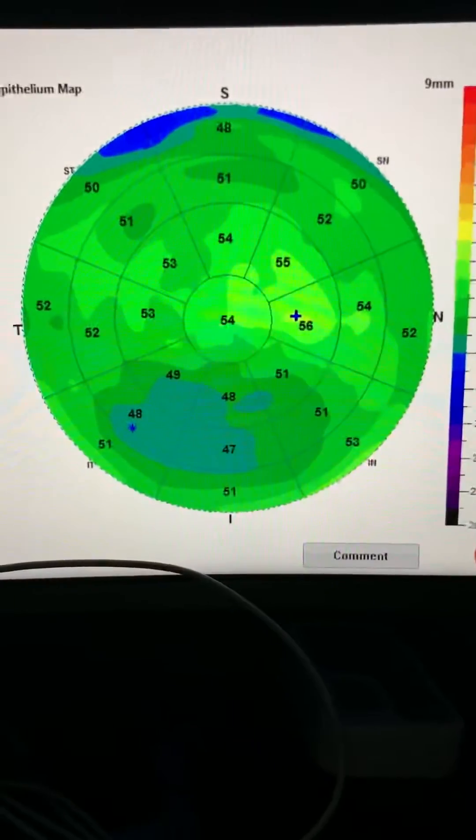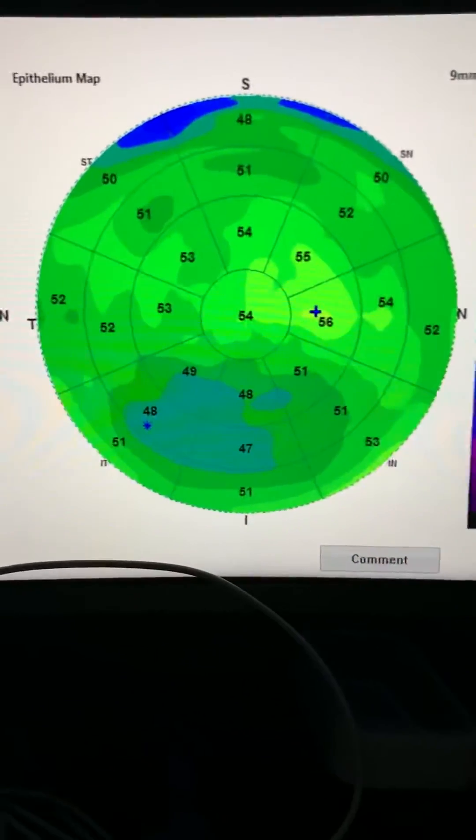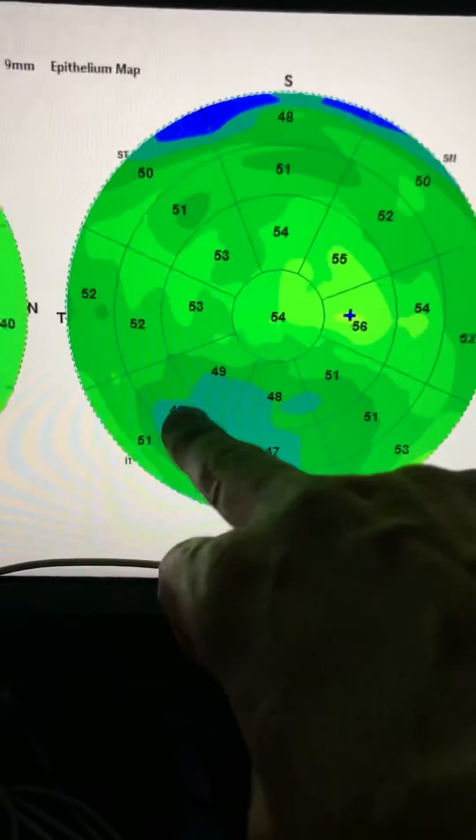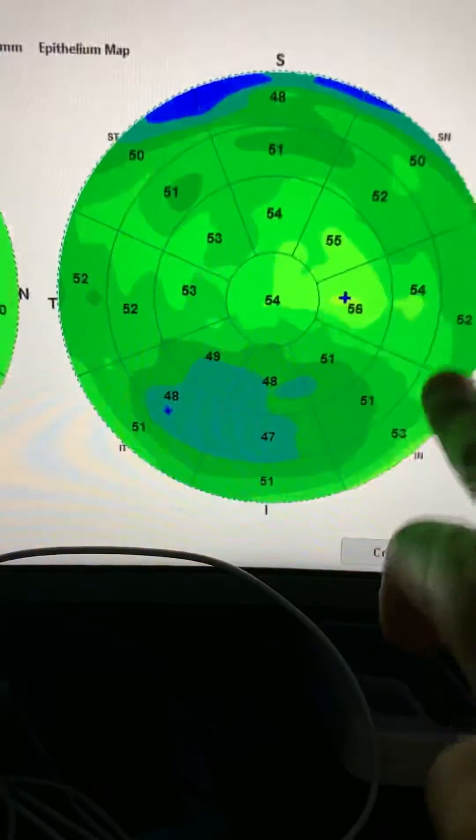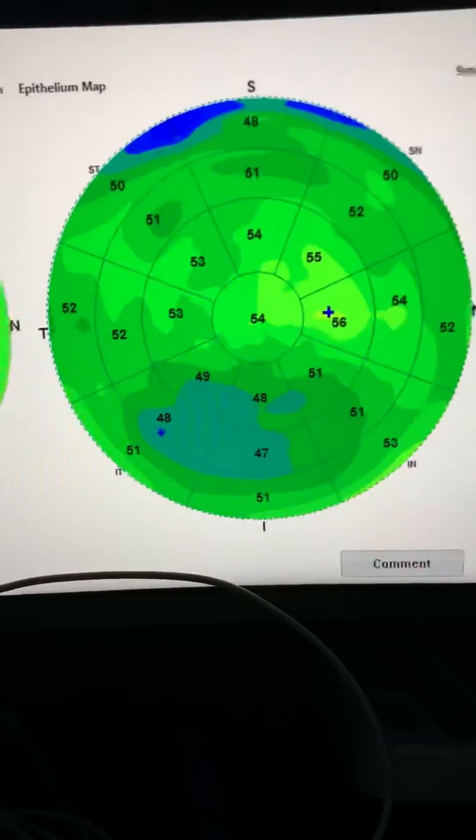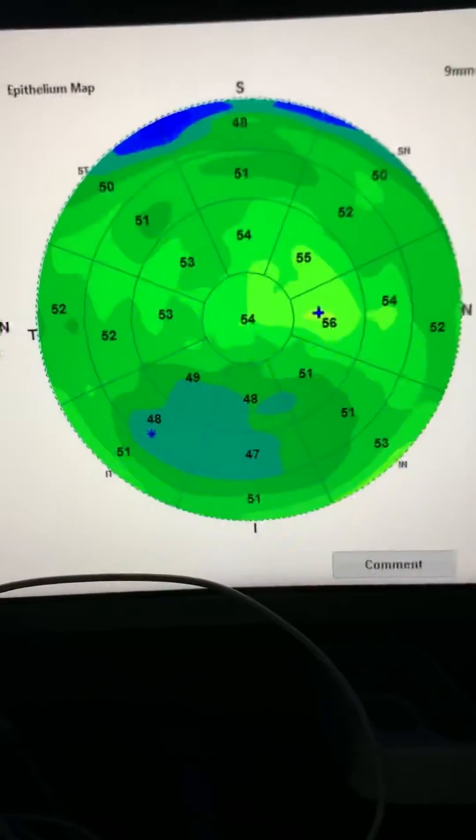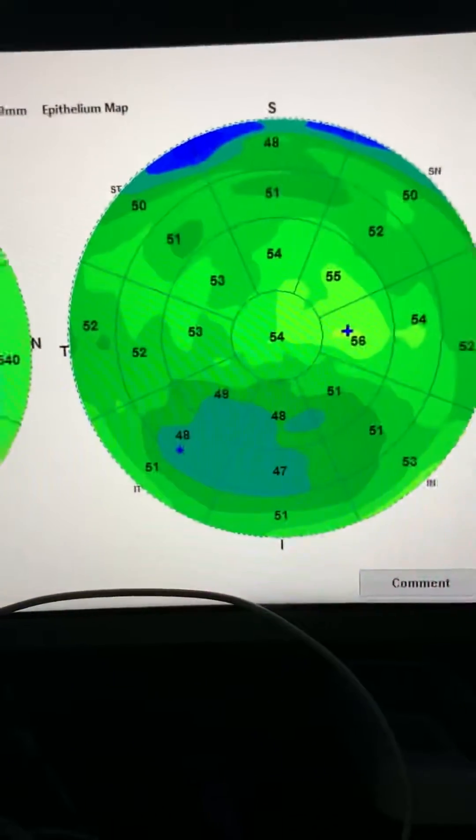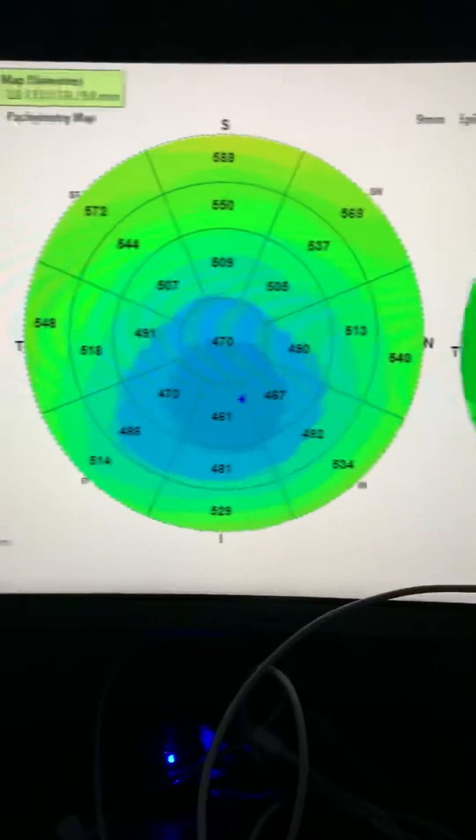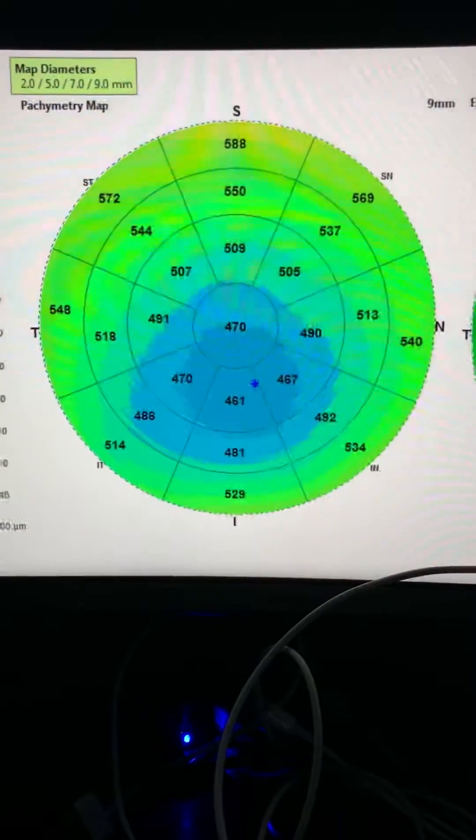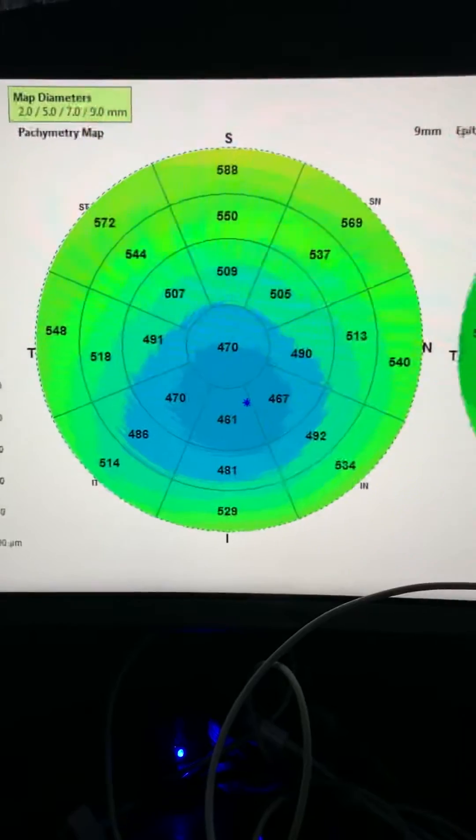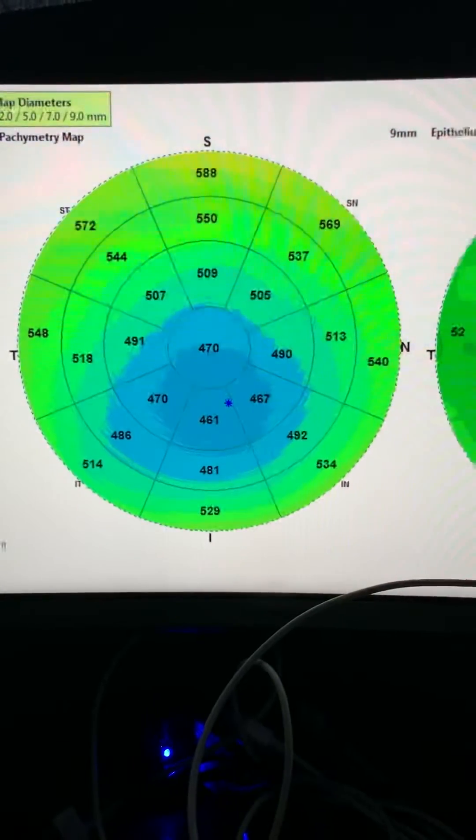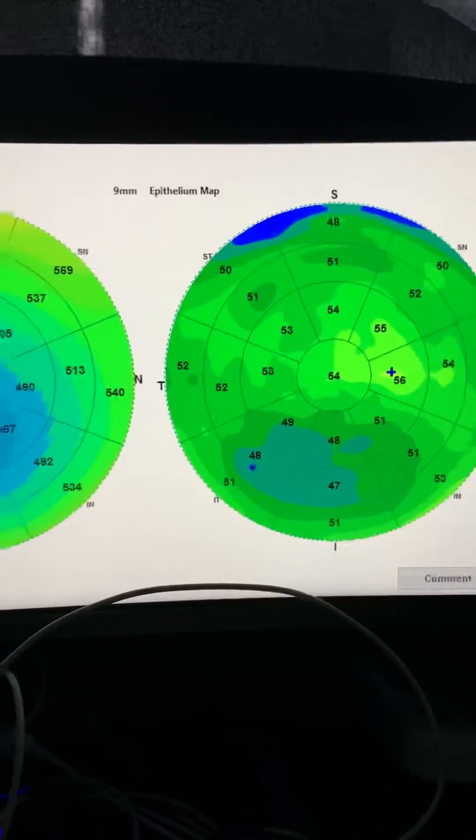And these are the epithelial maps from the right eye. The fact that the cone, the area of the cone has thinned, and the epithelium has thickened around it, tells us that there's active progression of keratoconus. And we will seek, by employing the Athens Protocol, to halt the progression of this awful disease for this young patient, and obviously have him avoid a cornea transplant.